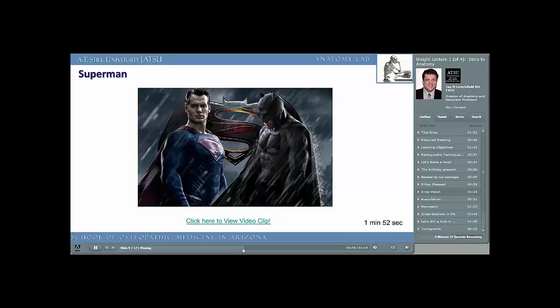I put some of these goofy images in to show you how far we've come in imaging the body using radiographic techniques. To image the body has always been one of the most useful purposes of x-rays, but as technology gets better, sometimes imaging modalities don't even need to use x-rays. An example is an MRI scanner. The MRI scanner actually uses magnetism to image the body.